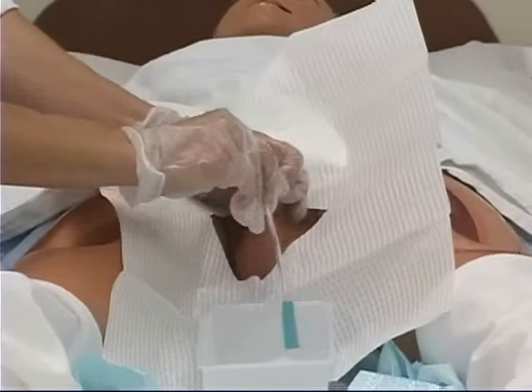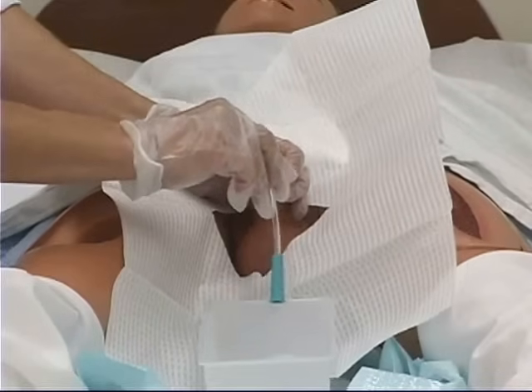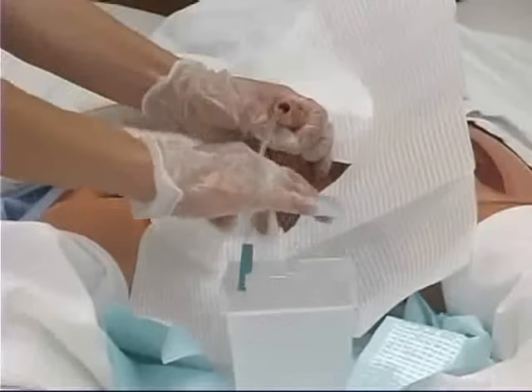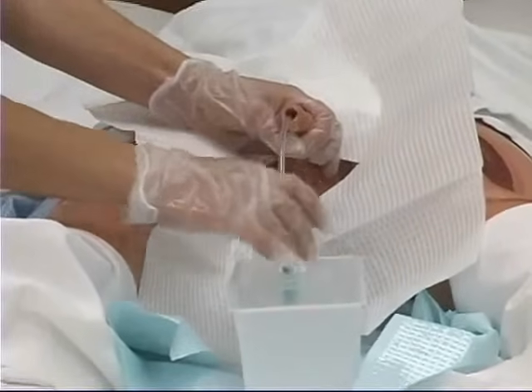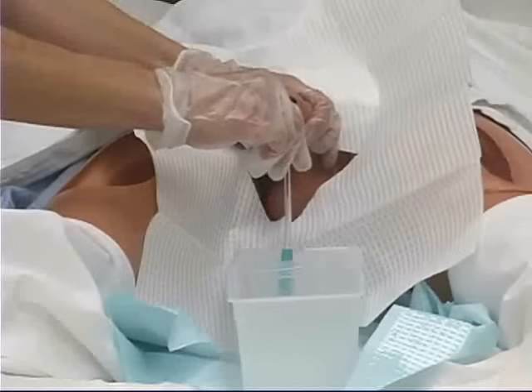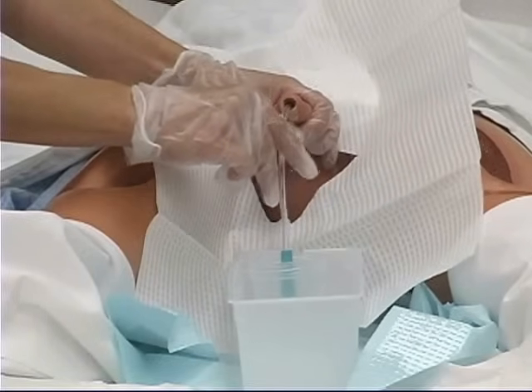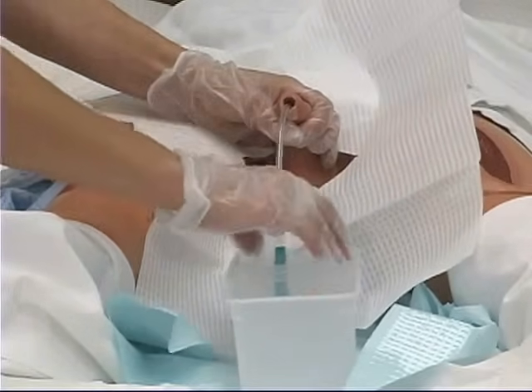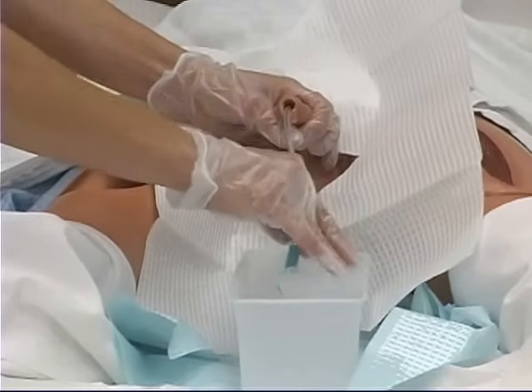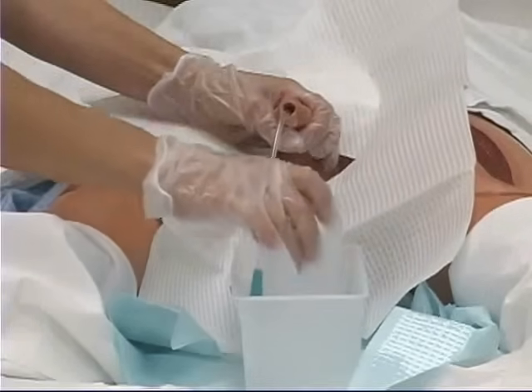You're going to want to watch for urine flow. At this point, we'll say that we're having urine flowing — I'm going to get my cup under here. For a urine specimen, you're going to want a minimum of 30 cc's of urine. Once you have 30 cc's or more, you can have the rest of the urine drain inside the basin.